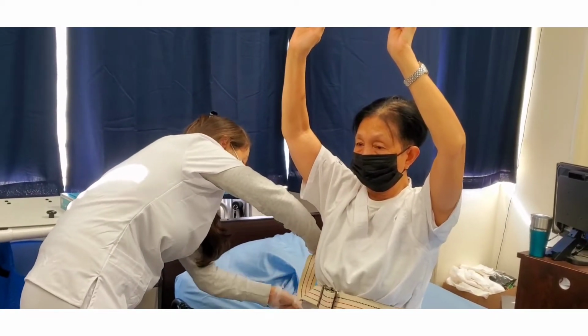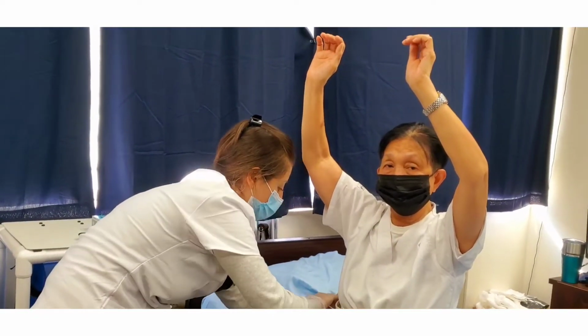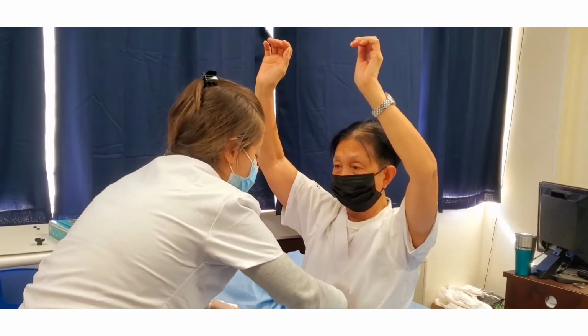To prevent any accidents, make sure it's two finger breadths in between. She could move slowly. Yes. Okay, two finger breadths.